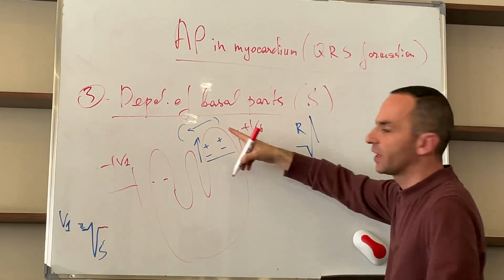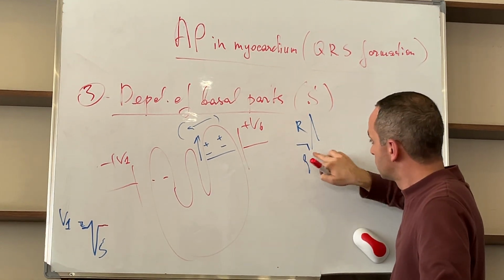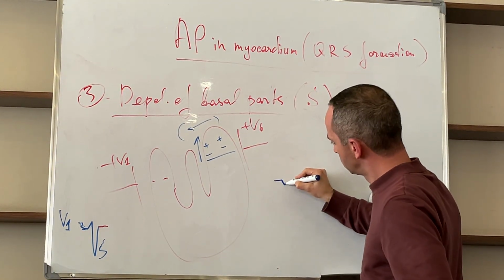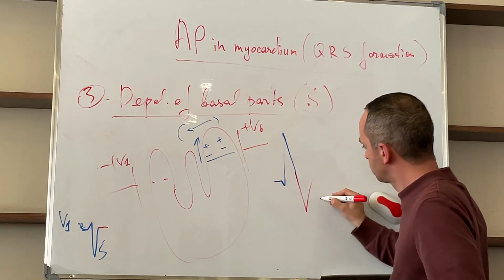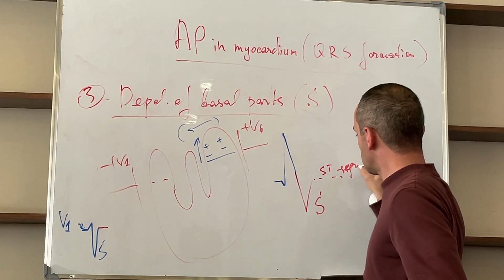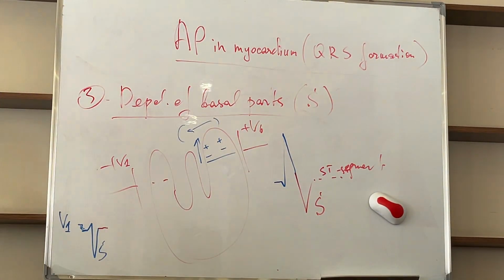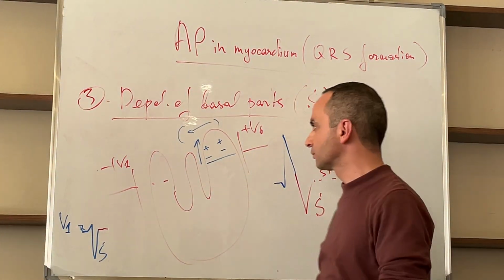Here we have opposite directed vector. So the negative deflection, S wave formation. Then when everything is negative, we'll have ST segment formation. But of course after S. This is depolarization of ventricles. Now starts repolarization of ventricles. T wave formation. This is clear.